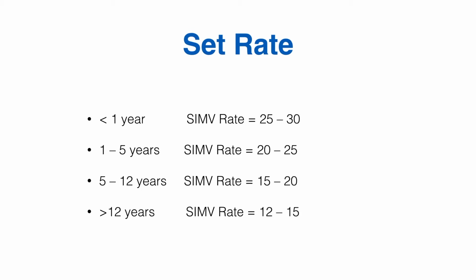So like I say, in medicine there's lots of different ways to do the same thing. Some are better, some are worse, so keep an open mind when it comes to ventilation. But if you're somebody coming from a neonatal unit, you may look at 30 breaths per minute in a paralysed neonate and wonder how they'll ventilate, but they ventilate very well on these settings.